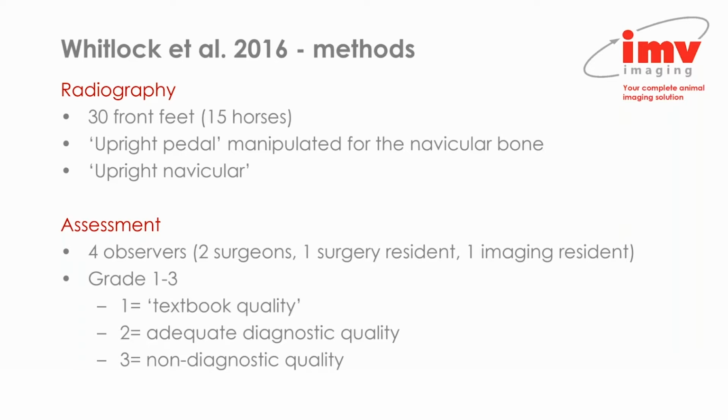There were 4 observers of various backgrounds, and they were asked to grade the image quality subjectively based on quite a basic grading system: 1 to 3, with 1 textbook quality, 2 adequate, or 3 non-diagnostic.